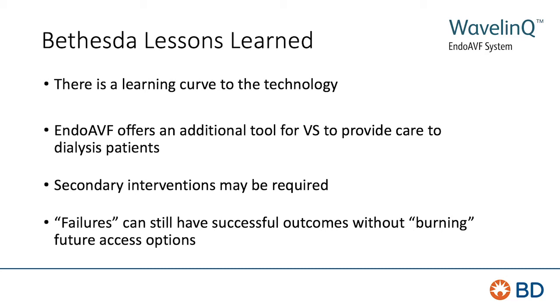I think that in a comprehensive dialysis access program, which is what we hope that everybody will have, the EndoAVF is a great tool. It's not going to be perfect for everybody, but it is a great tool, and especially, as I've pointed out previously, for the CKD4 patient who has adequate metrics to have an AV fistula placed prior to the initiation of dialysis, it is a great option, and it's one that patients are receptive to since it's minimally invasive.